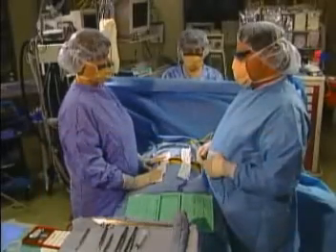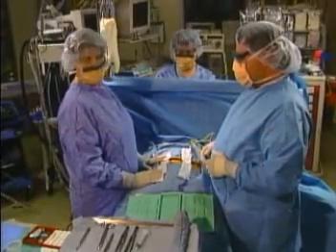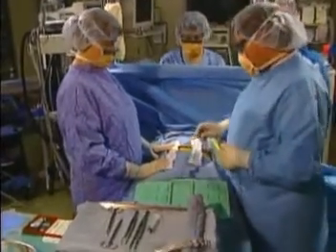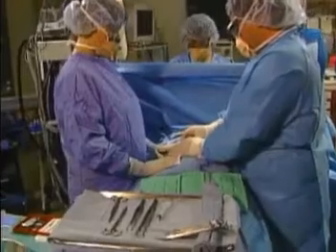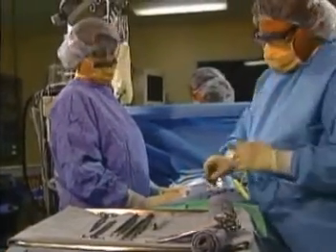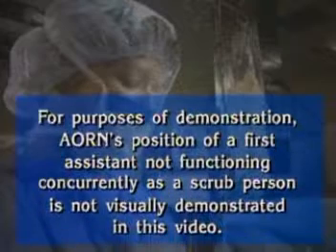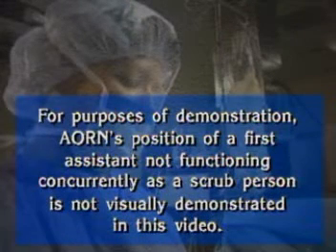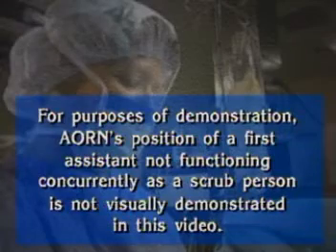Aseptic principles guide the perioperative team as they create and maintain a sterile field for performing surgery. These techniques isolate the surgical site, separate it from the surrounding unsterile environment, and prevent contamination from reaching the open incision. For purposes of demonstration, AORN's position of a first assistant not functioning concurrently as a scrub person is not visually demonstrated in this video.